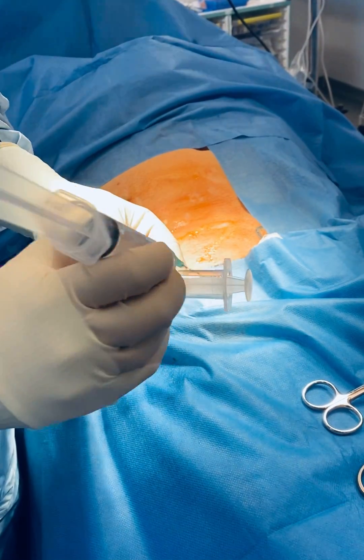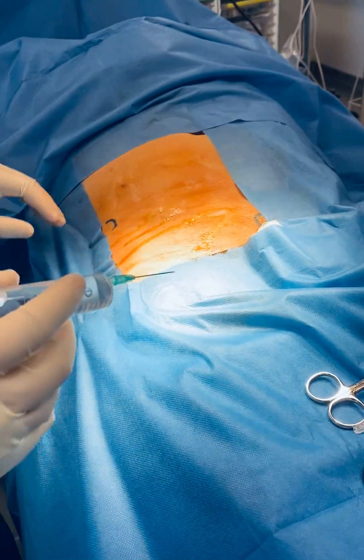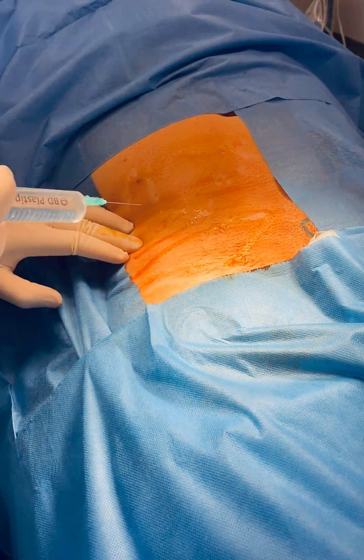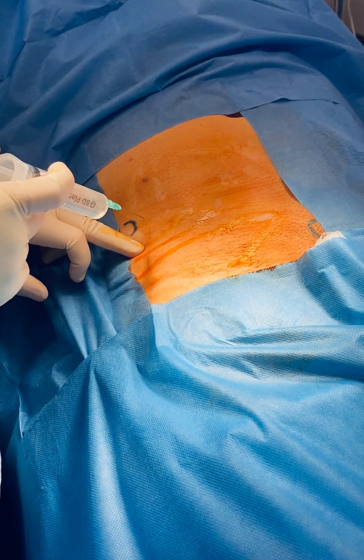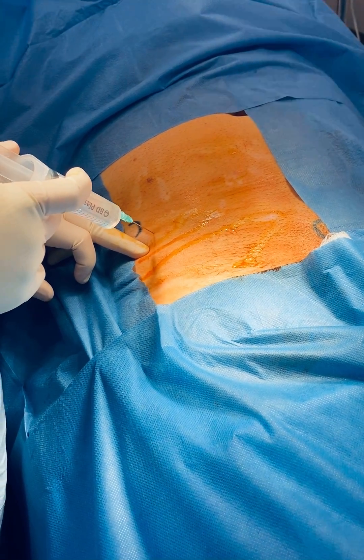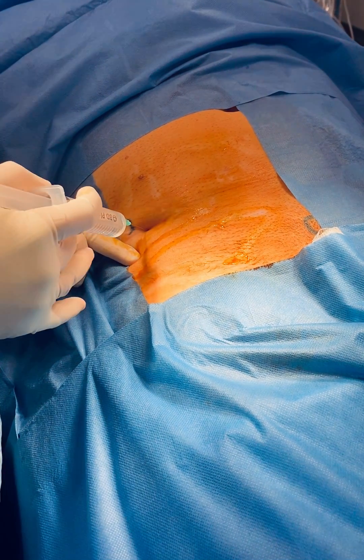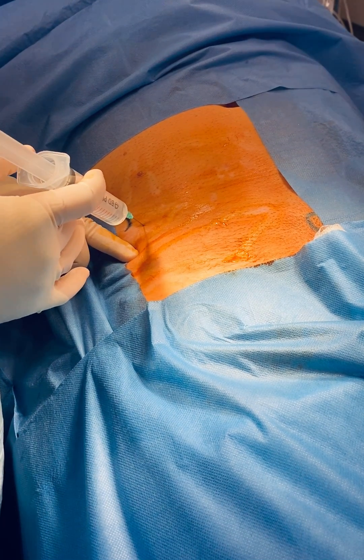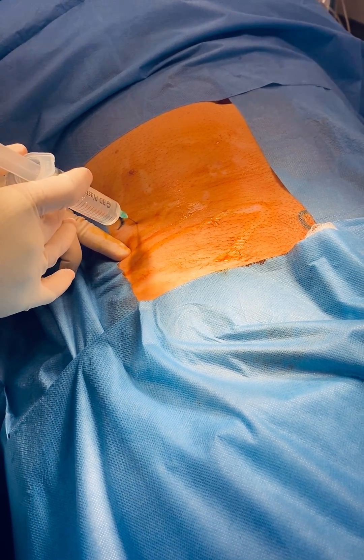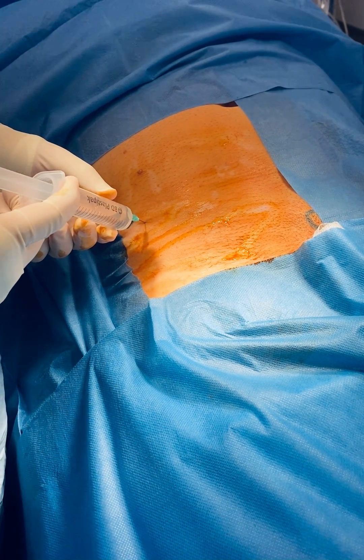The needle is blunted by tapping against a hard plastic surface. For the deeper infiltration there are only three points. The first point is one centimetre medial and inferior to the anterior superior iliac spine, and what we're feeling for with the blunt needle is two pops to get through the external oblique.